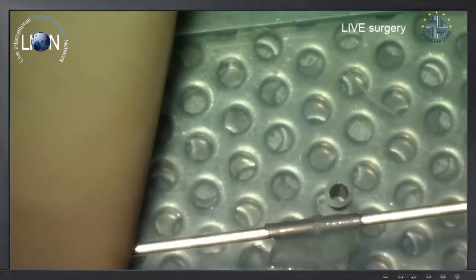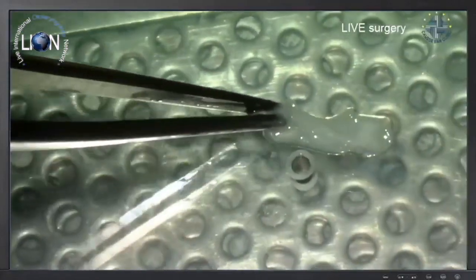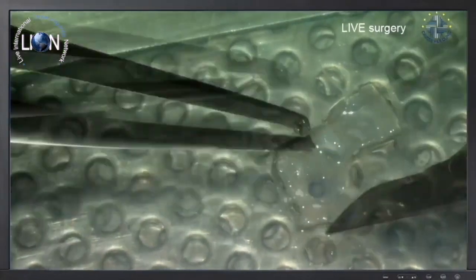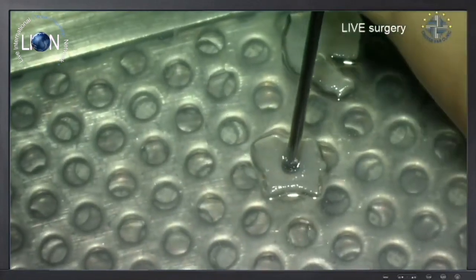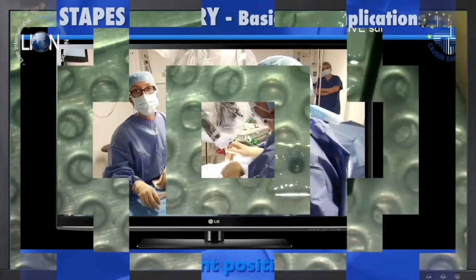And then I'm going to cut the vein. I'm not going to use the entire vein, but just part of this. And you see now I'm facing the intima of the vein, and there's a hole on the glass plate like this. So I'm going to push the vein down into the hole. So they are still facing now the intima. The sticky side is down to the glass plate, like this.